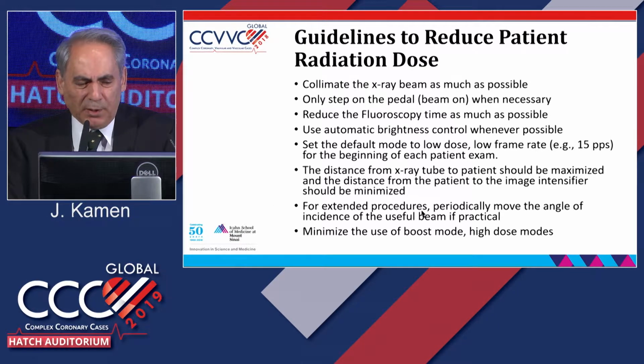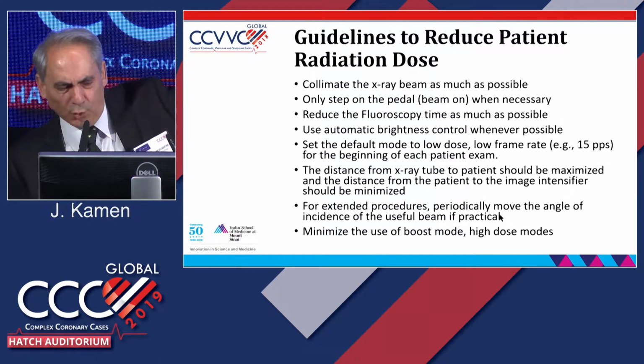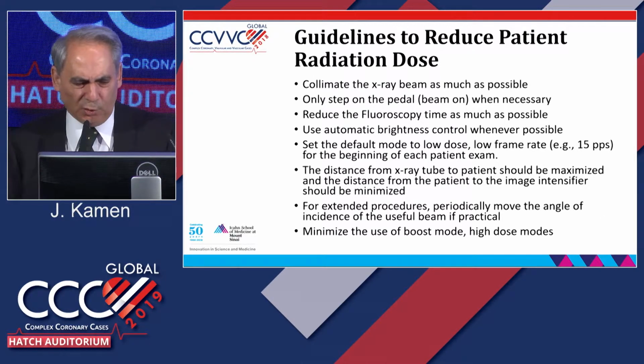For extended procedures, move the angle so you do oblique projections to distribute the dose, and minimize the use of boost mode, the high dose mode.